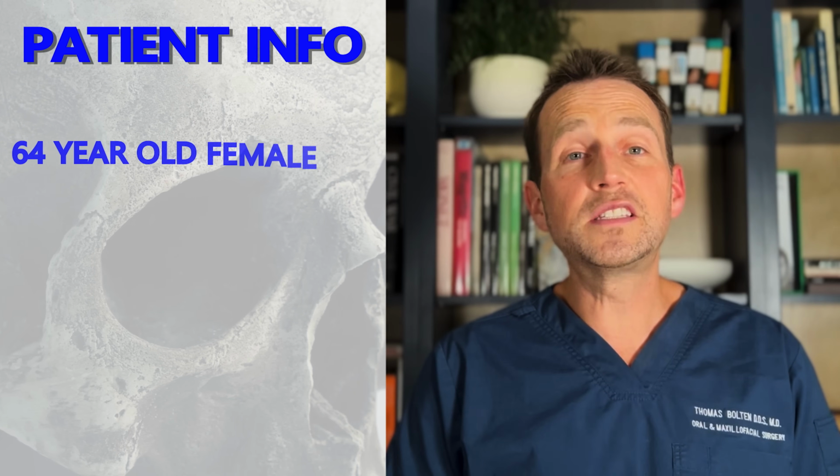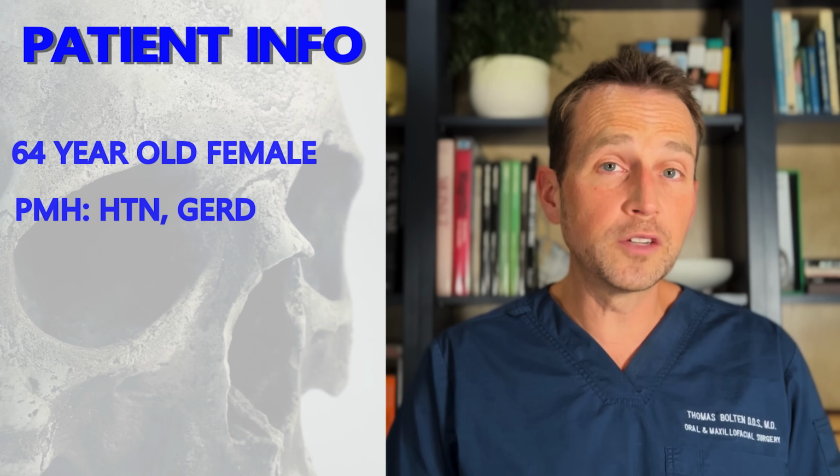Today we're reviewing how to drain a simple dental abscess. This patient is a 64-year-old female who was referred for treatment of a swollen cheek. She recently developed severe pain with a tooth in her left lower jaw, tooth number 18.